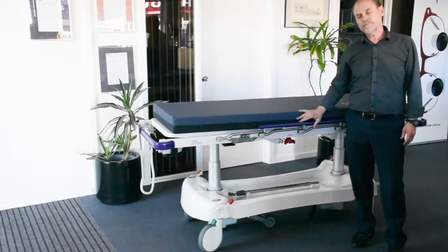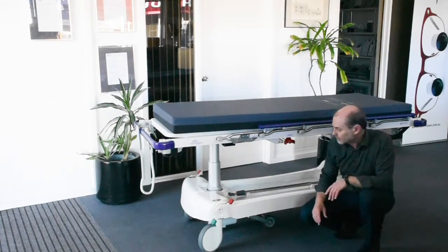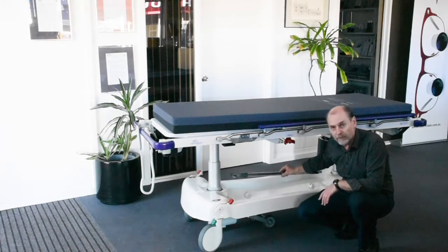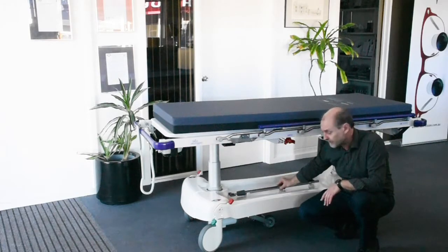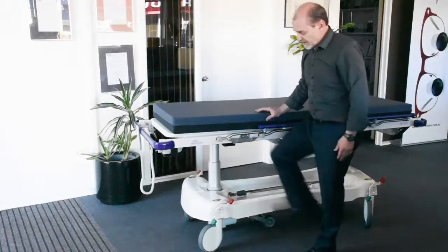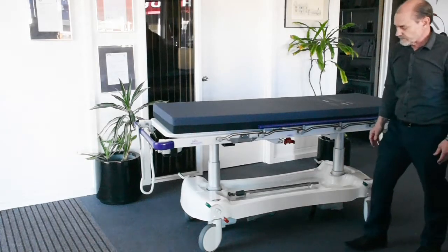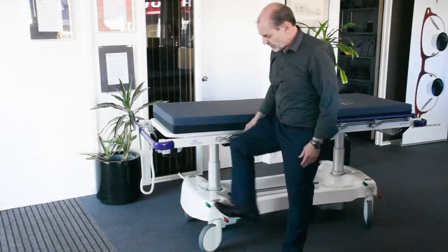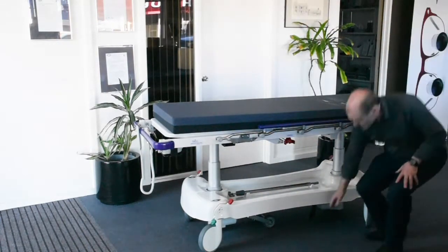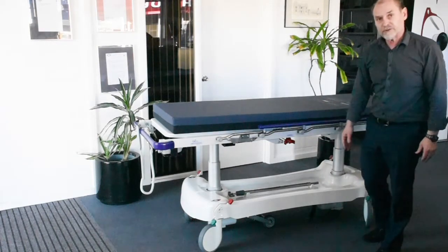Below the barouche top, we have two electric rams which do all the lifting and tilting. The base is recessed for storage, and that includes a storage spot for the IV pole if you need to remove it from the top of the barouche. We've got brake pedals — activating the red brake provides central locking to all wheels. There's also a central steering system: pressing down on the green pedal drops the central wheels down, making manoeuvrability a lot easier.